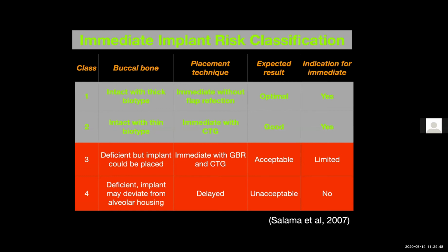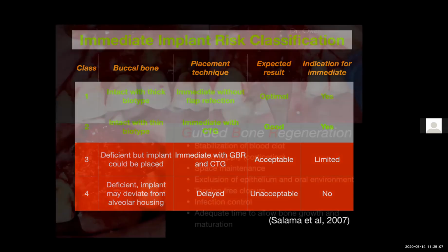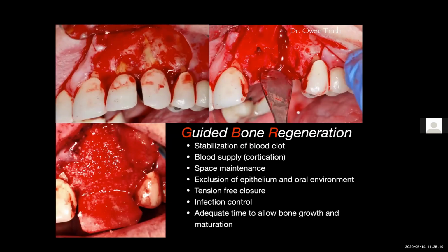This is a compromised situation because you will lose some amount of the buccal soft tissue, including some papillary height. So the question that remains is how large of a defect would absolutely prevent us from placing an immediate anterior implant. Here's an example. In my opinion, immediate implant in this case should not be done, and here's why. Severe dehiscence on the facial of teeth number 10 and 11 was noted on the cone beam scan and was confirmed after I reflected the flap. If you encounter this scenario, I recommend a 2-stage surgery.